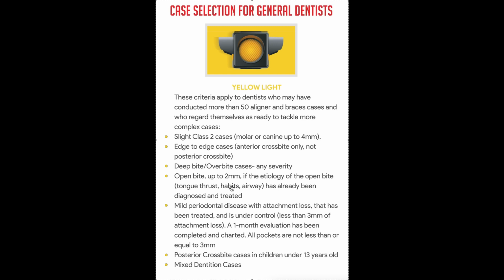And I can't say this enough times. Any patient with an anterior open bite, you can't go straight into Invisalign. You can't go straight into braces. It will relapse and weird things will happen. Sure, they're going to make a Clin Check for you, but it's not going to happen. I can tell you that. And it's not going to retain. So I'm going to keep saying this again: any patient with an open bite must finish their OMT therapy and get a sign off from the OMT.